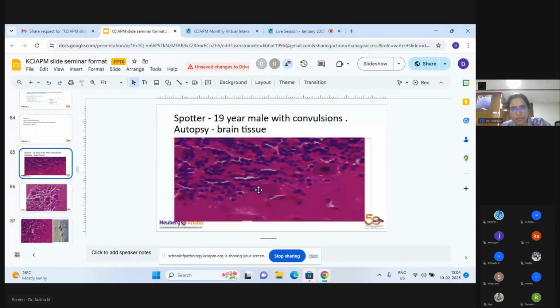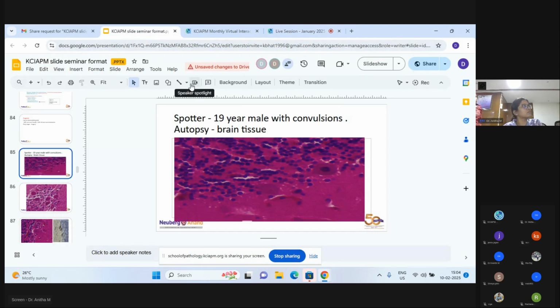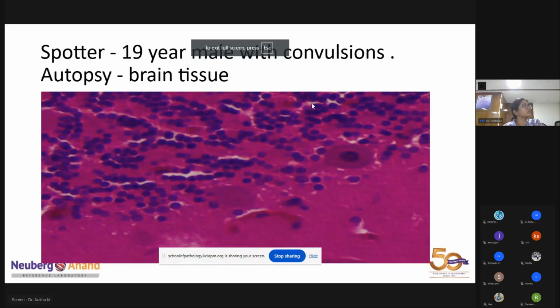Is my screen seen now? Visible? Can you identify which part of the brain this is?